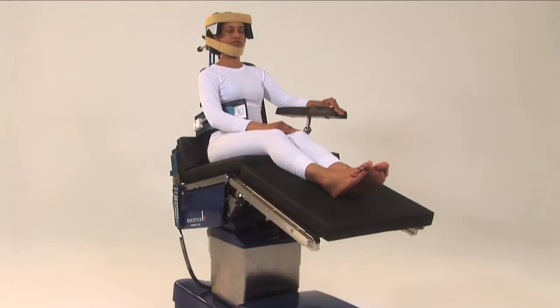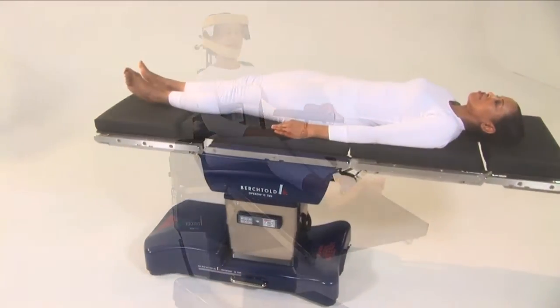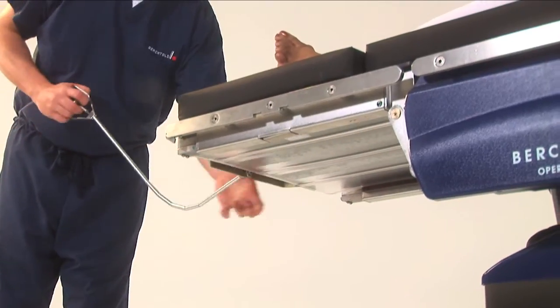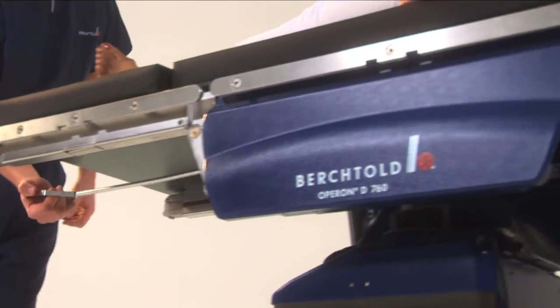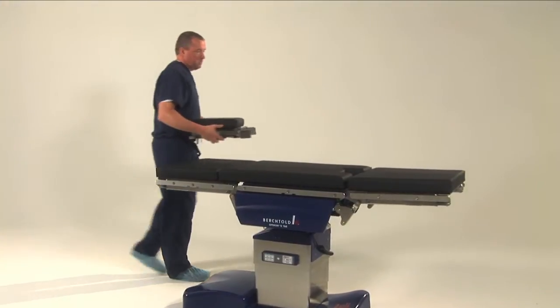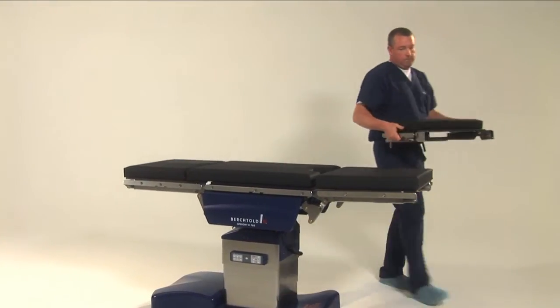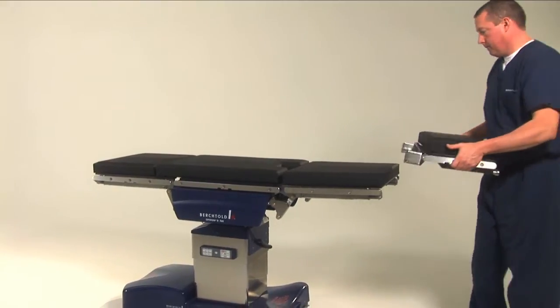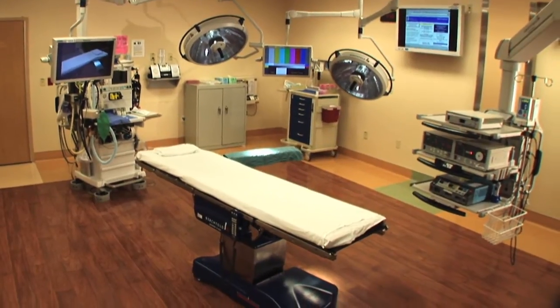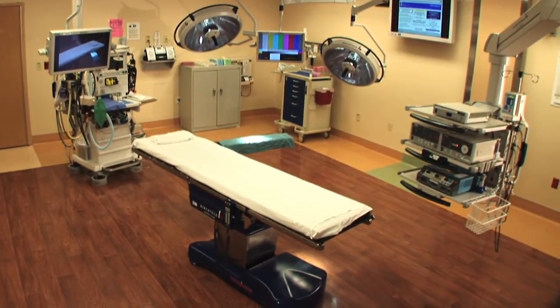With radiolucent phenolic tabletop construction, 18.3 inches of lateral imaging window and integrated x-ray channel, the D760 eliminates the need for additional x-ray tops. By moving the head section to the end of the table, the imaging length can be extended to nearly 50 inches, making the D760 a perfect choice for hybrid OR surgical suites.